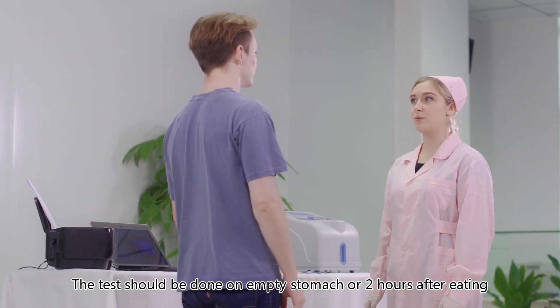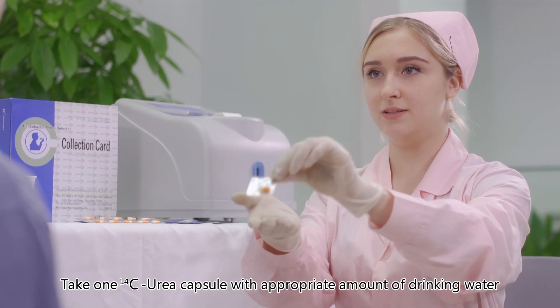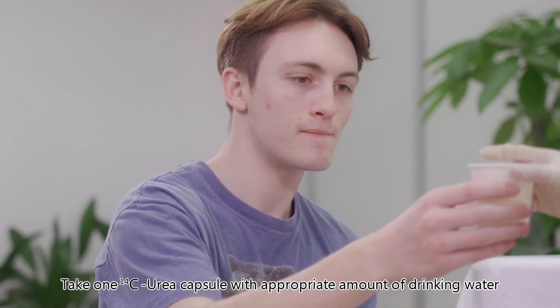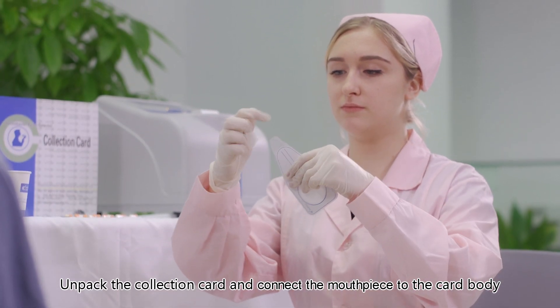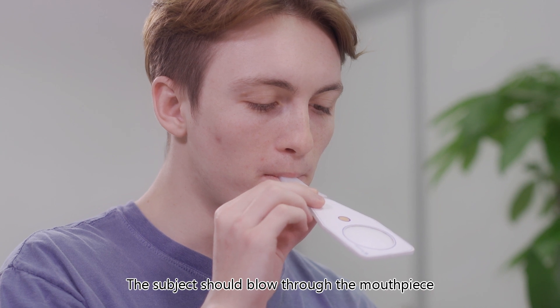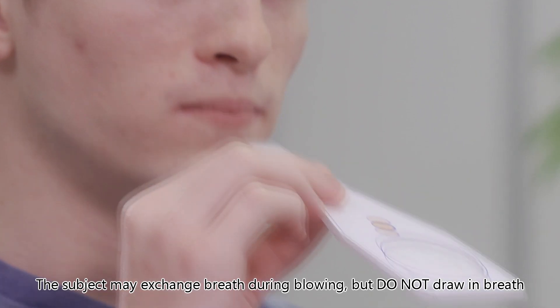Sample collection: the test should be done on an empty stomach or two hours after eating. Take one carbon-14 urea capsule with appropriate amounts of drinking water. Sit still for 15 minutes. Unpack the collection card and connect the mouthpiece to the card body. The subject should blow through the mouthpiece with appropriate force for as long as possible.